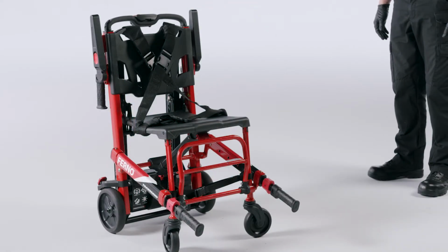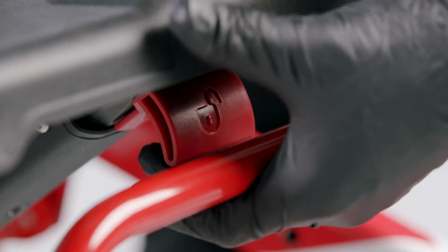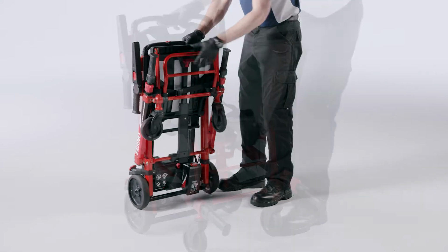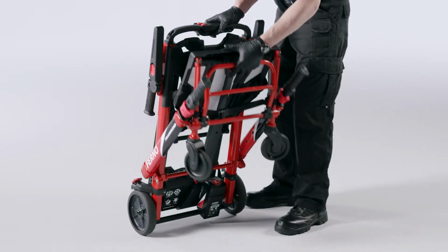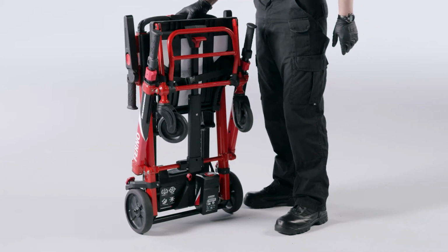To fold the chair, buckle and arrange the restraints to prevent interference. Pull the release lever forward, then begin folding the chair. Tilt the chair forward to keep the swivel wheels rotated outward, and press the seat against the back panel frame until the lock engages.